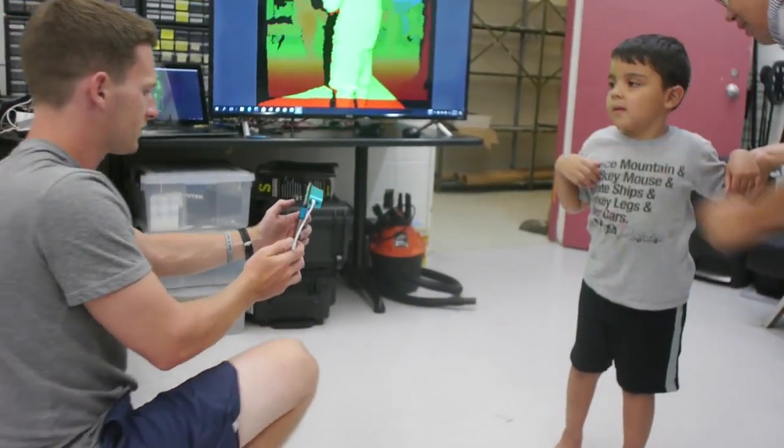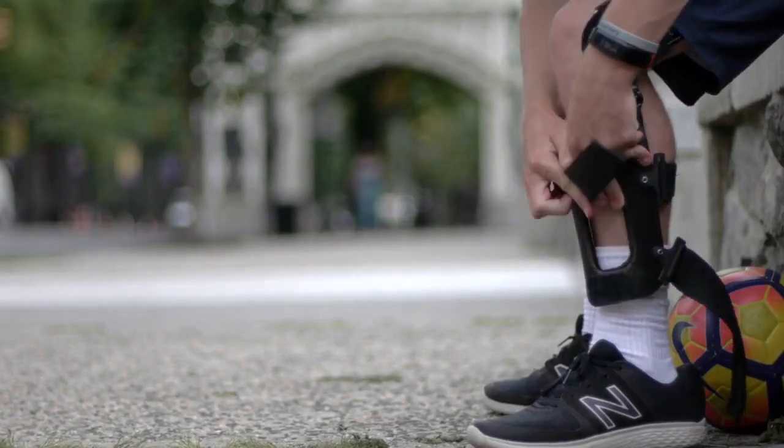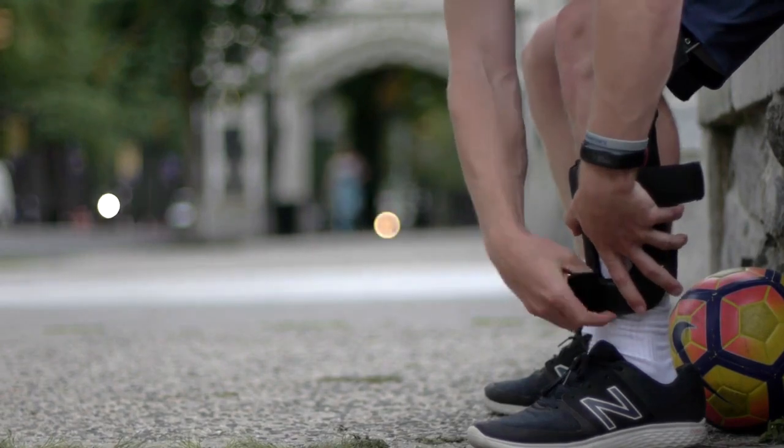The wearable part is customizable using 3D scanning and 3D printed carbon fiber. Therefore, the robot fits the user very well, and it can be worn over clothing.